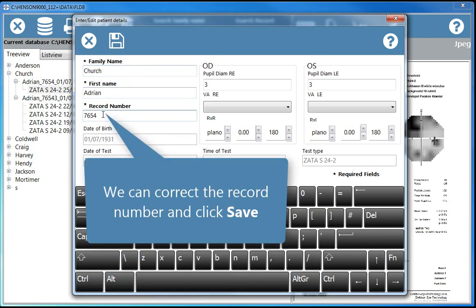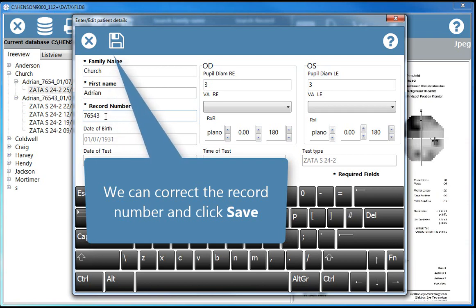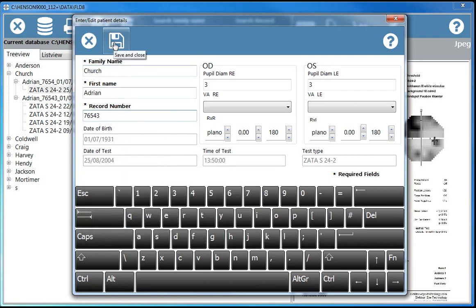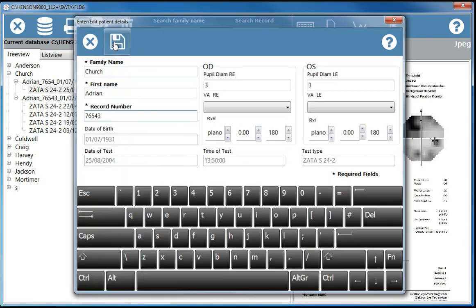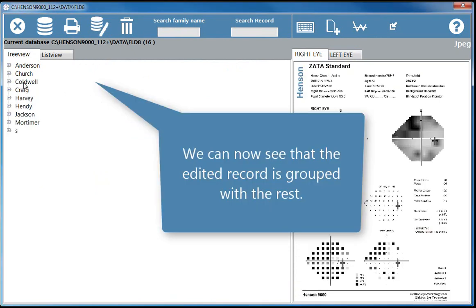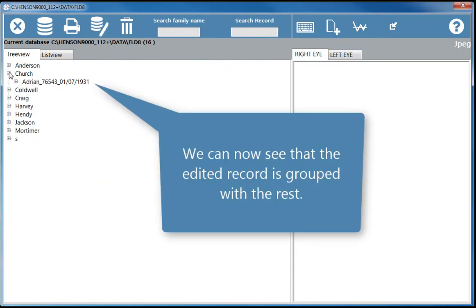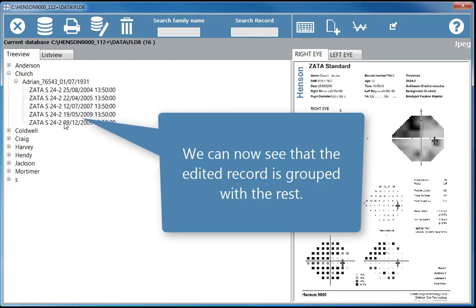We can correct the record number and click save. We can now see that the edited record is grouped with the rest.